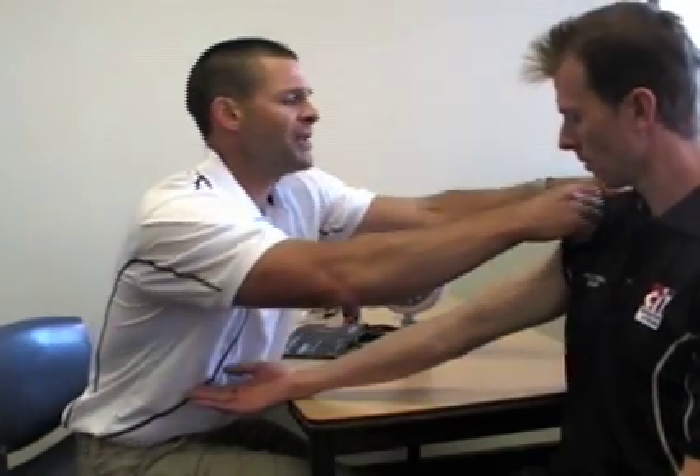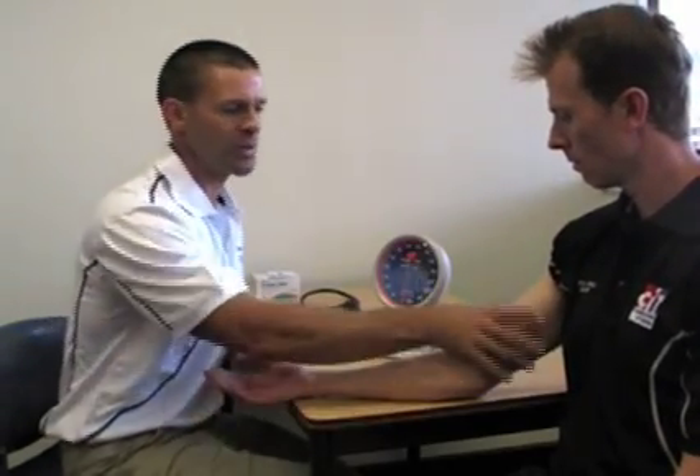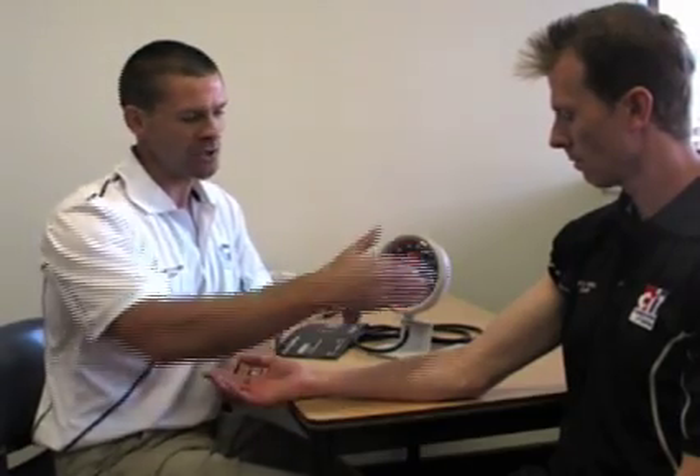Simply roll up the top sleeve, tuck it in, and have the client rest the arm down. You want to expose the upper arm because that is where the cuff will go. If the client has a long-sleeve top on, it is okay to take blood pressure over clothing, following the same protocol. You may just want to roll up the sleeve enough to get access with the stethoscope to the point where you listen for the pulses.